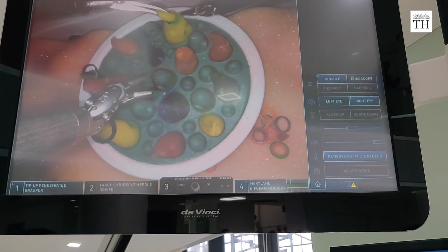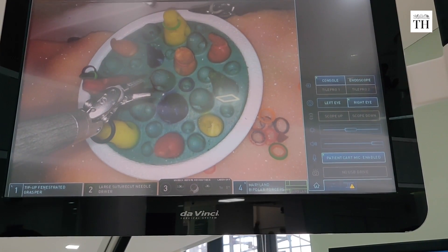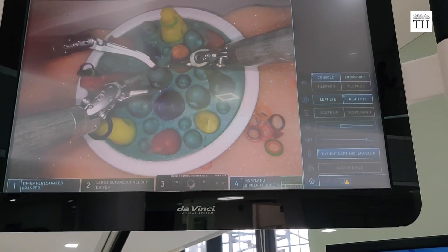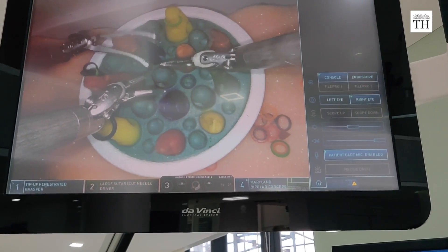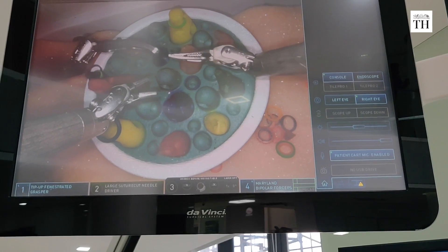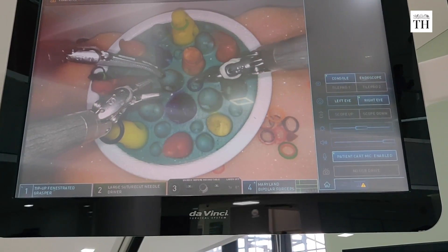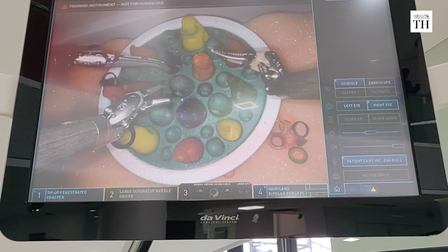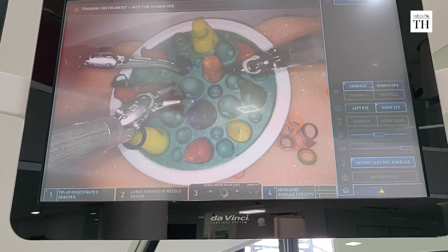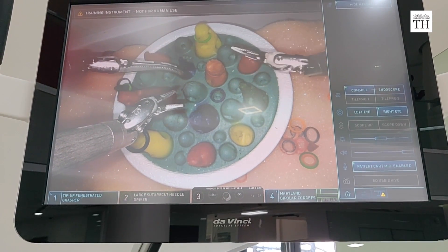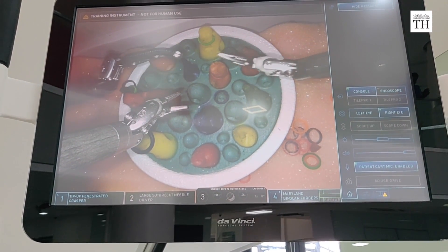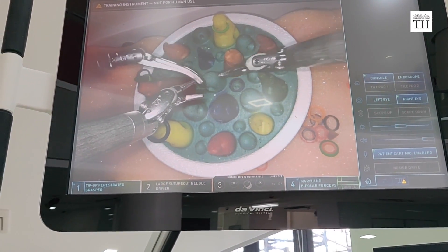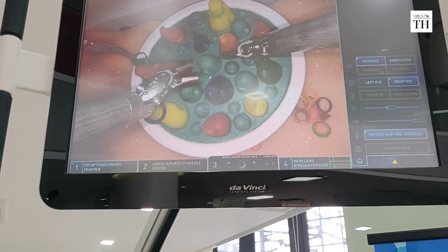We can see very complicated tasks being performed with the two arms. The third arm is stationary, but we can interchange the arms and utilize all four arms simultaneously. The movement of the robot is precise — minus tremors, minus unwanted movements. That's how it has a lot of advantages over conventional surgery or laparoscopic surgery.